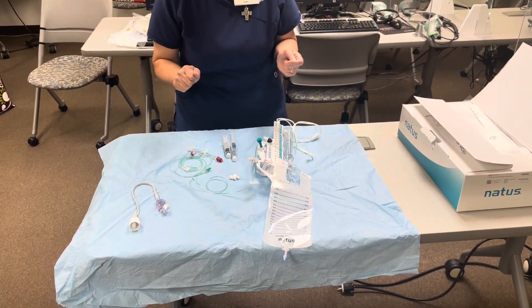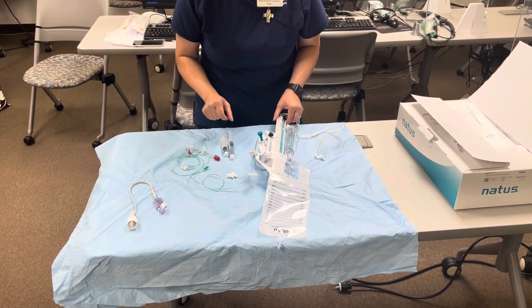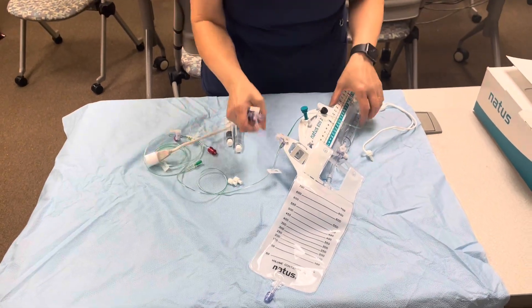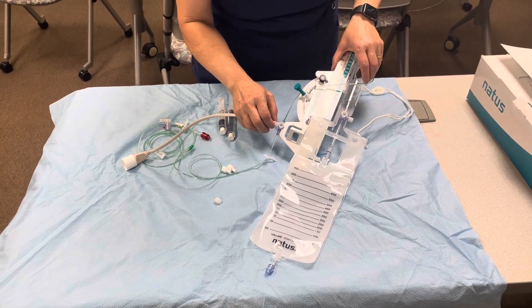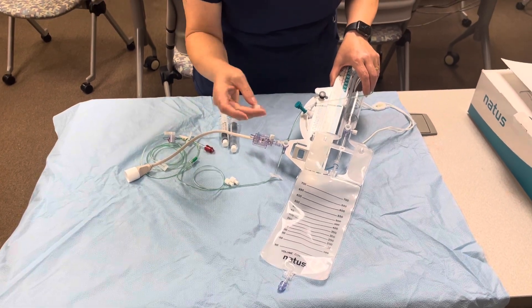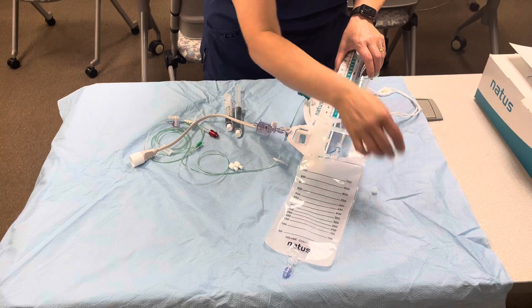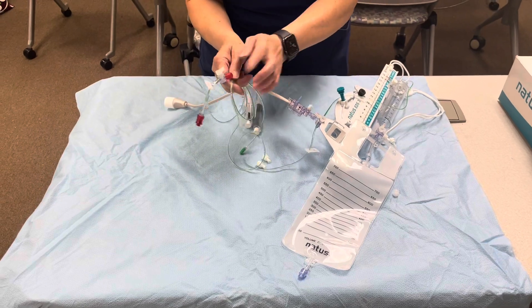We are going to prime our EVD drainage by connecting the transducer to where we're going to level our EVD to measure where the ICP is. Please remember the caps that come with the packaging are not closed caps — we're going to change them to closing caps. The one closer to the patient is already a red cap, and that is a closed cap.